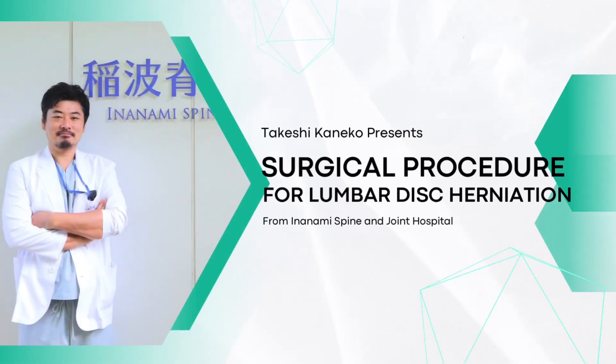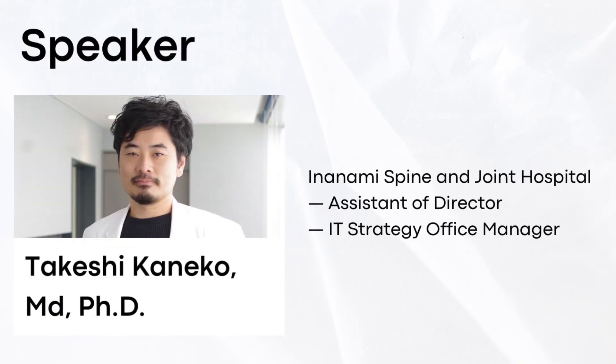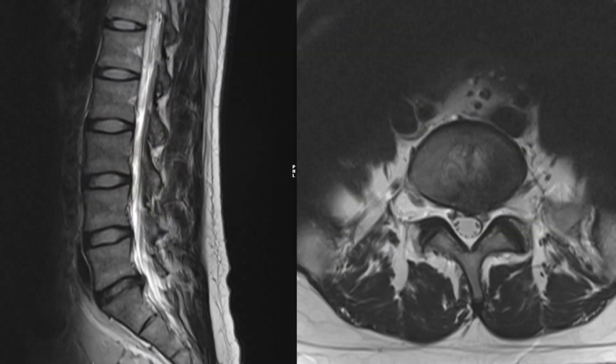I will explain the surgical procedure for partial flavectomy that I am performing. The patient has a herniated disc at the L4-L5.